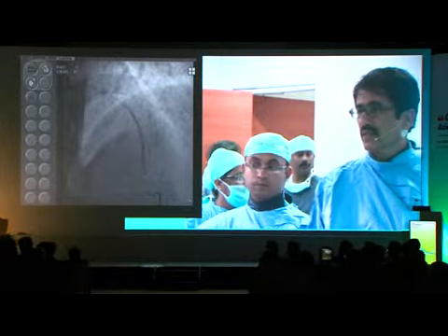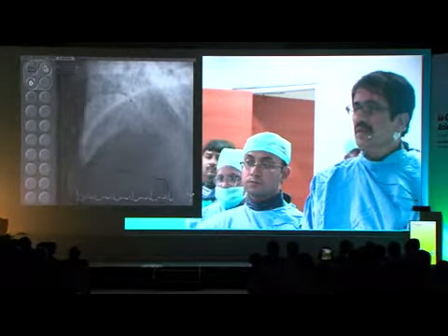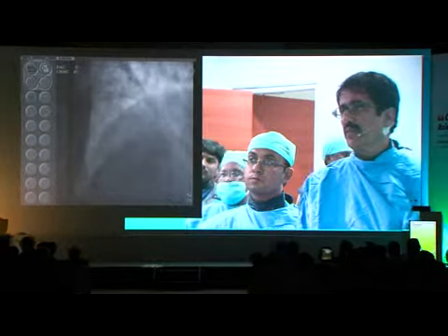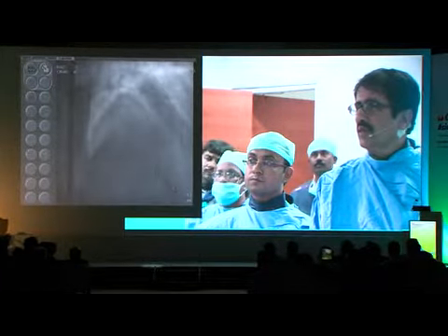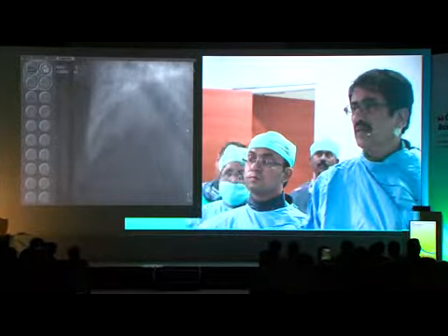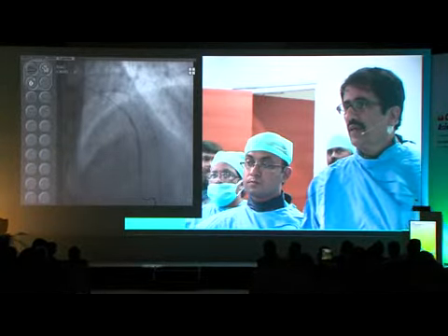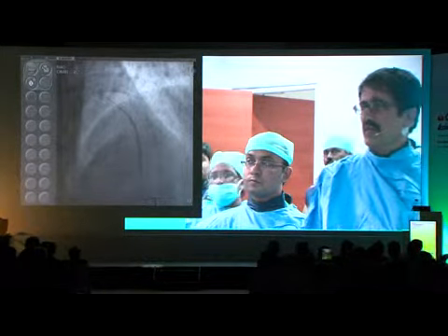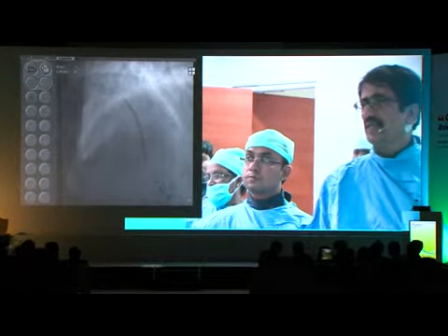Is it your practice to directly dilate with a drug-eluting balloon, or initially you dilate with a normal balloon first and then use it? No, we did a pre-dilatation. That's actually a very good point, that we should not treat this drug balloon as a regular balloon. You have to create a bed, and the drug balloon should go with no resistance at all. In a way, it's good that we are holding, the patient is tolerating it very well. We are at 80 seconds, and another 10 seconds, then we'll deflate. We'll give GTN.